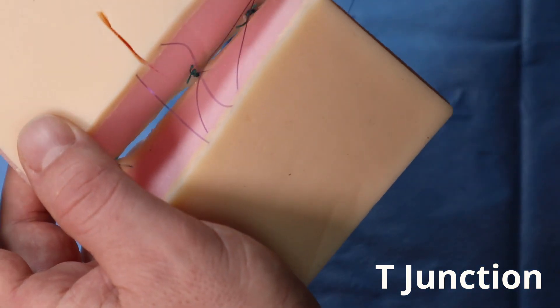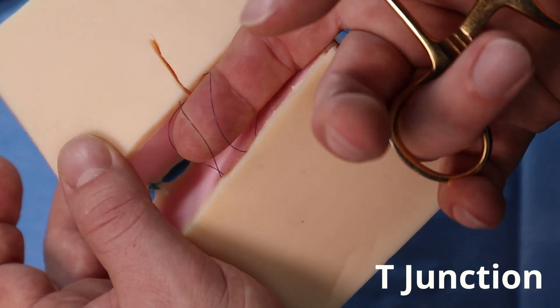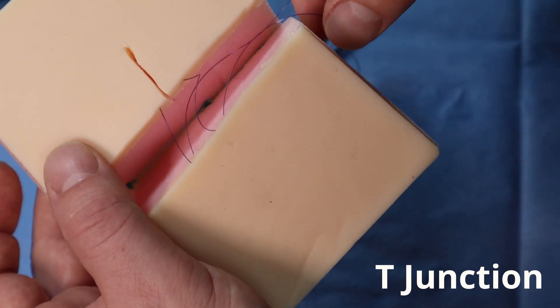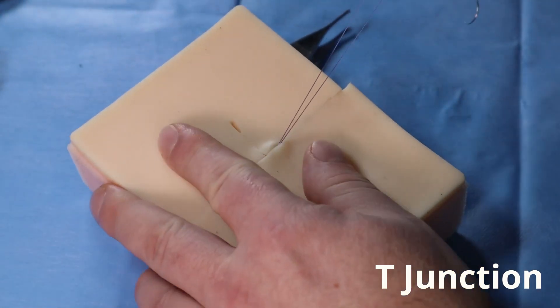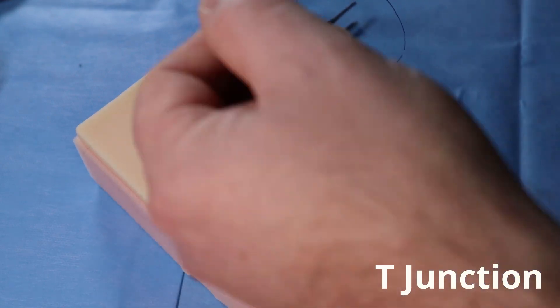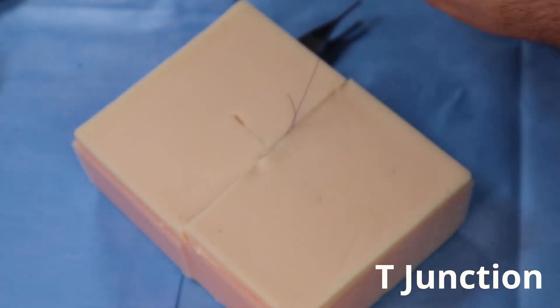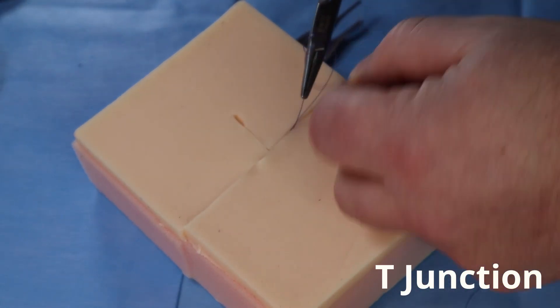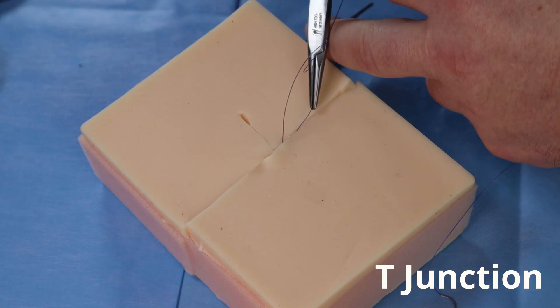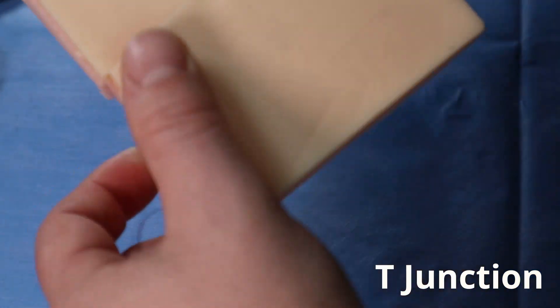Now I have both the tails on the same side, underneath the suture, so my knot will be buried. So let's bring that all together — and look at that, it comes right together. Now I could tie a knot in that and we'll be done. Do that real quick. Cutting it flush, and then that's buried.